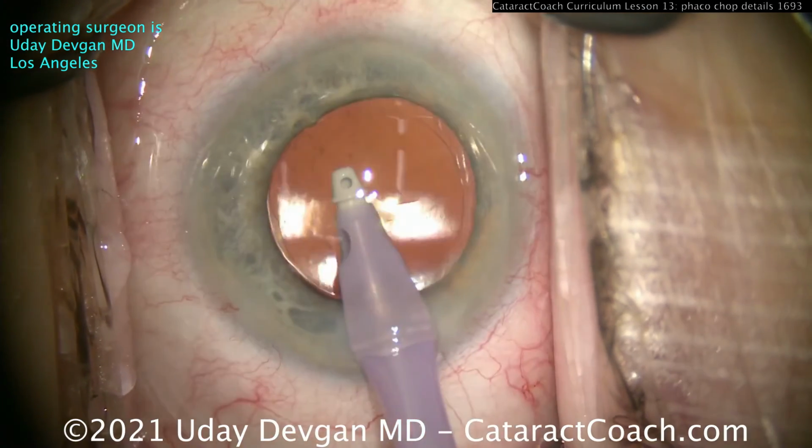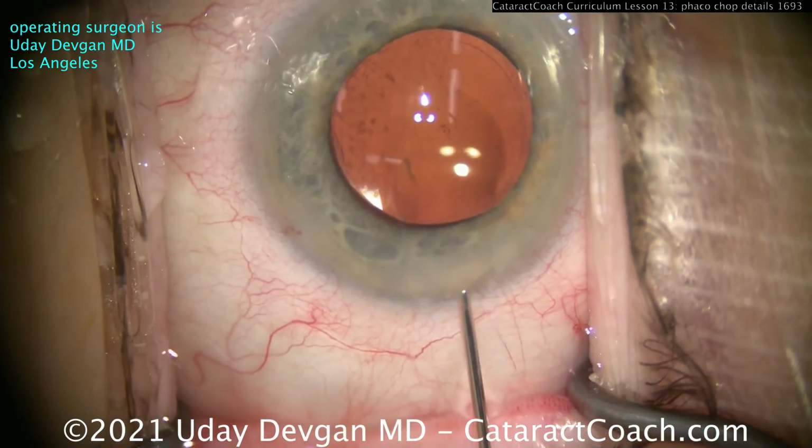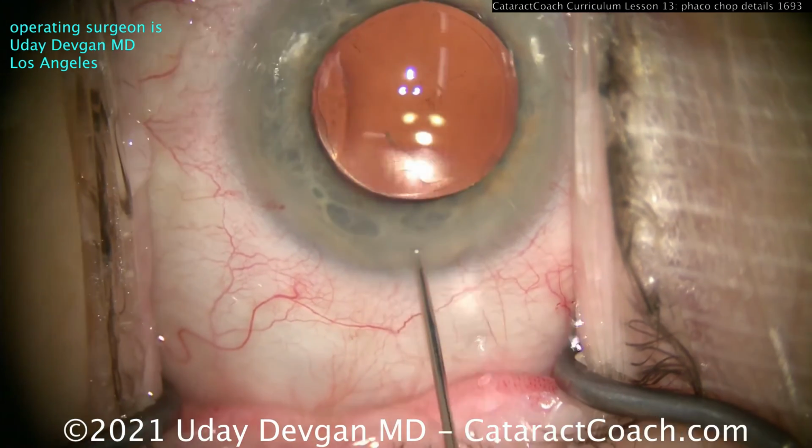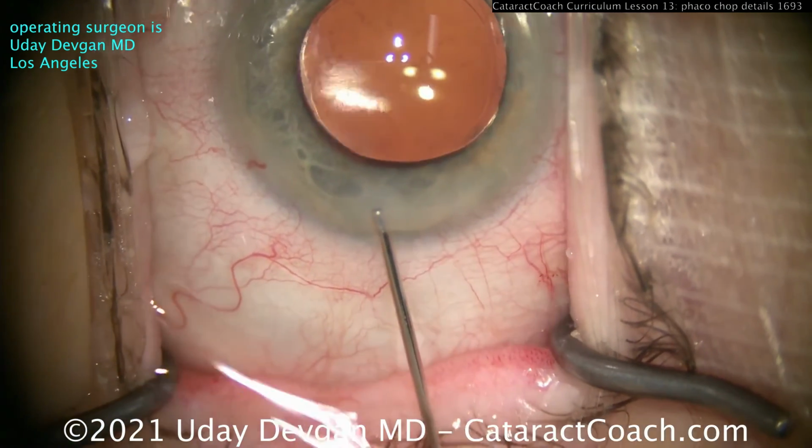You guys know this by now. What is that? The first and the fourth Purkinje image. And that big blurry stuff down there, that's another Purkinje image, right? Which one is that? If you don't know, you better look up Purkinje image on CataractCoach.com.